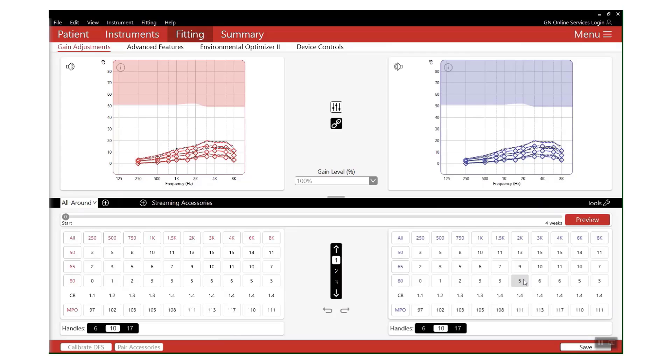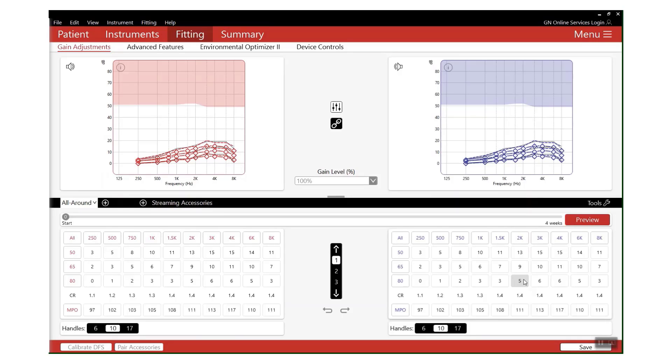By then clicking Activate, both hearing aids will now work together to increase from 80 to 100 percent over the next four weeks. This means there's less need for that patient to come back into clinic to have an interim adjustment. They will naturally get used to the sound of amplification from 80 to 100 percent smoothly as those hearing aids increase.